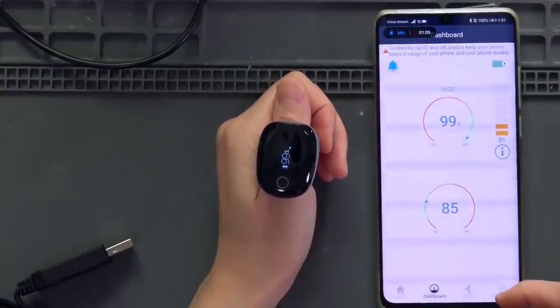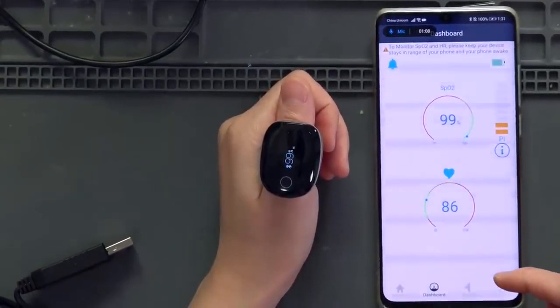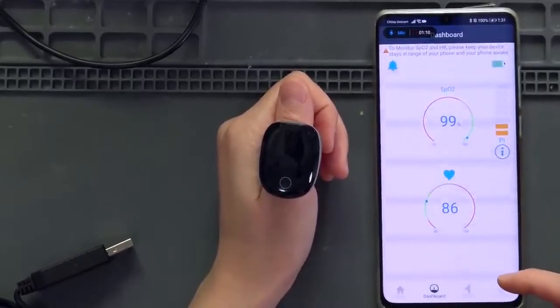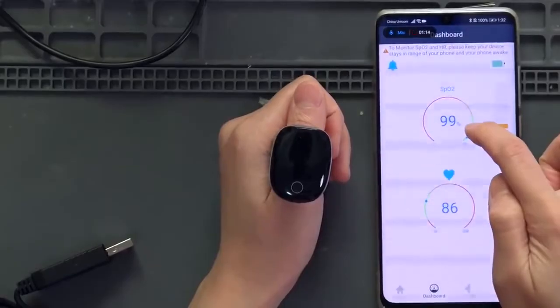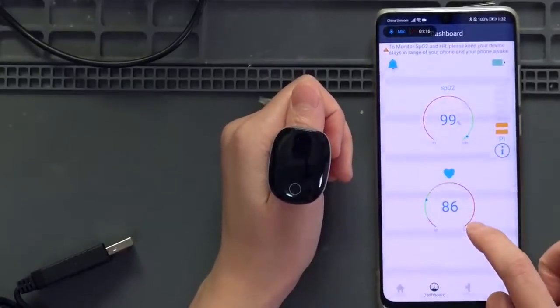To monitor SPO2 and heart rate, please keep your device in range of your phone and your phone unlocked. Right now my SPO2 is 99% and my heart rate is 86.